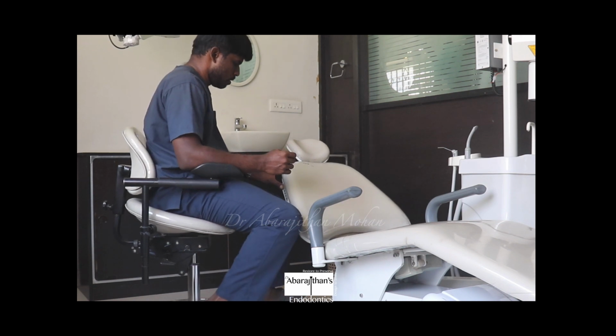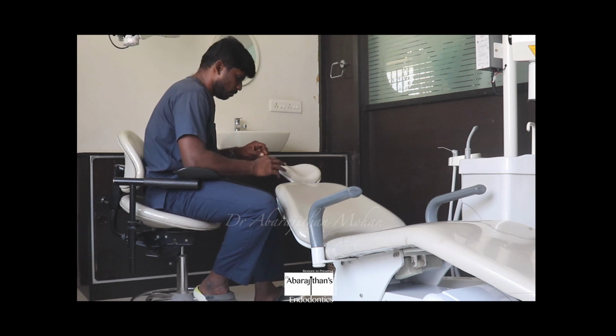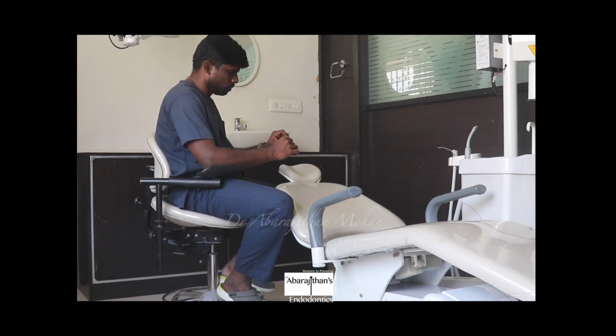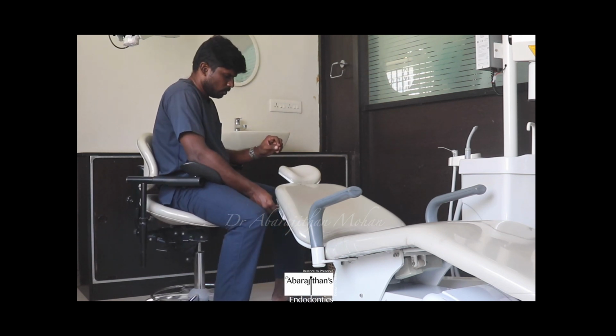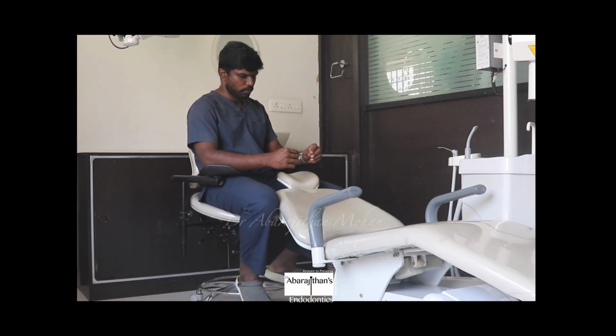After I am sitting in a comfortable position with the thighs parallel and with my forearm parallel to the floor, the chair is adjusted in such a way that the patient's head is going to be at my elbow level. This is going to be the same for both the maxilla and the mandible, though there are some differences which we'll be talking about specifically in the coming slides.